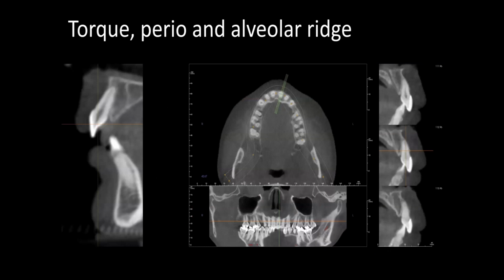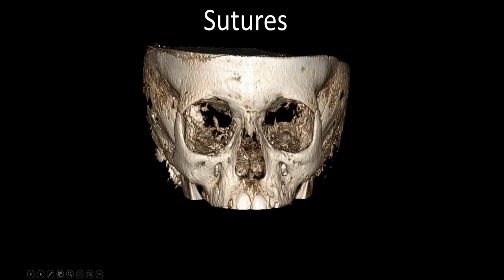What about torque on patients? What about angulation, right? That's so important. I mean, we talk about supplementary numbers and so forth, but what really matters, in my opinion, is how the teeth emerge from the alveolar process, right? So we can do this on every single tooth, right? With certain in vivo features.